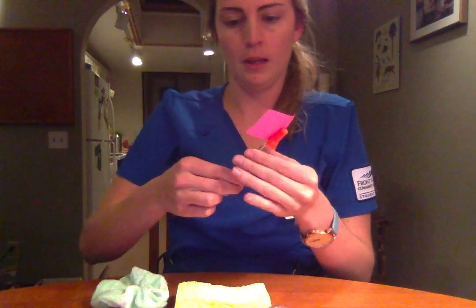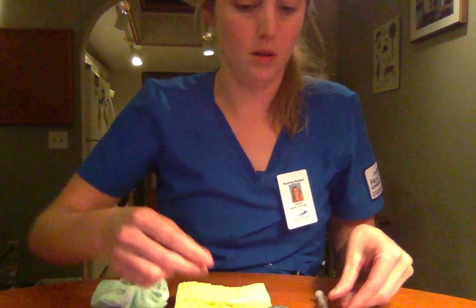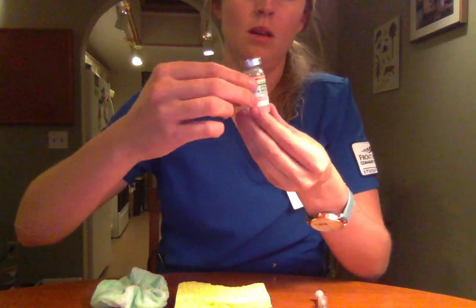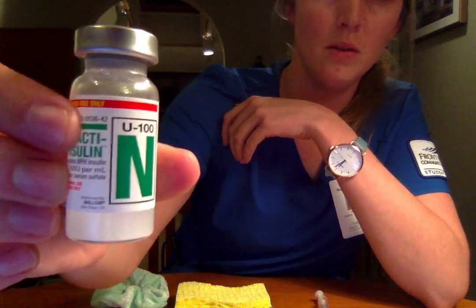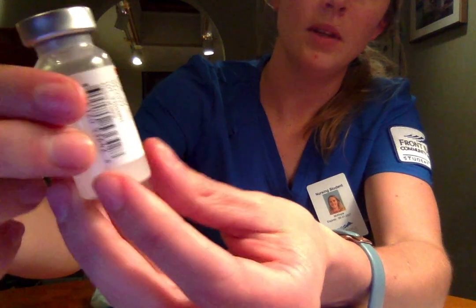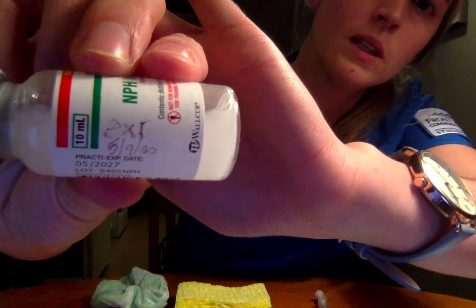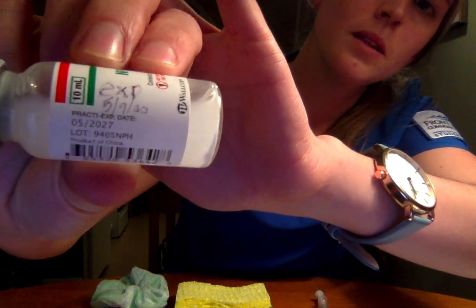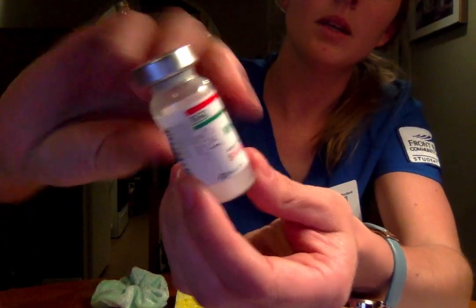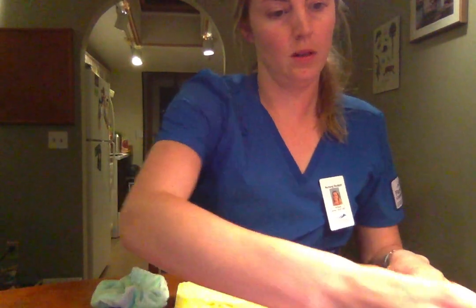Okay, now I'm going to engage the safety back, and I will show you the vial. So NPH insulin there, U100, and I have the expiration dates. Okay, that says EXP with the expiration date there and the manufacturer. Okay, so let's do that one more time. Alright, so now I can go ahead and I'll scoop this back.